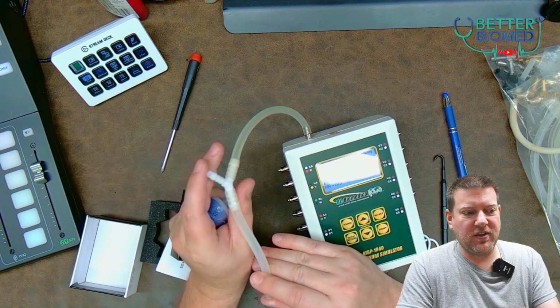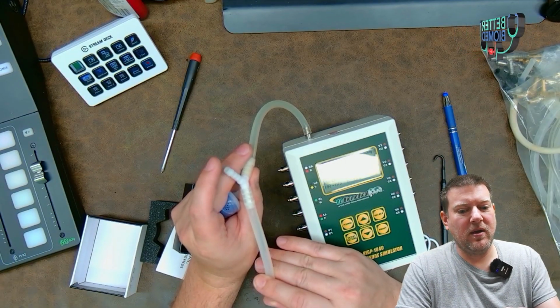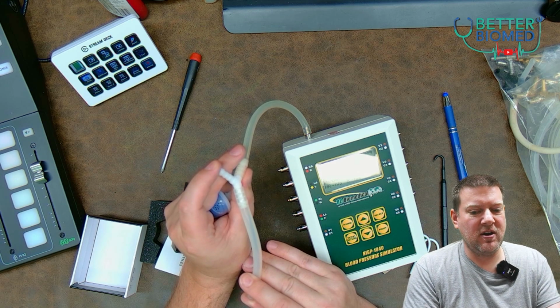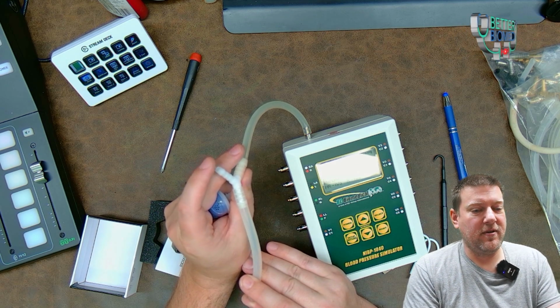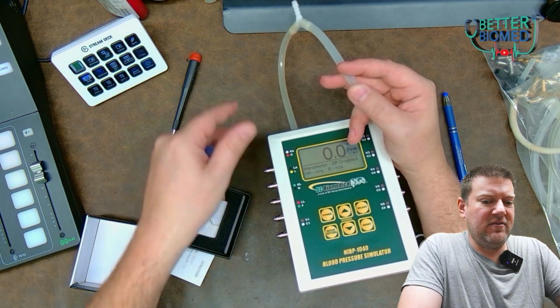It is registering nothing. But look what happens if I just put my finger on the tip. This is how sensitive the 1040 is. It's got an excellent pressure transducer. Take a look at that. That pressure sensor is really, really detailed. Sorry, guys. I've got it so that y'all can't even see it right there.